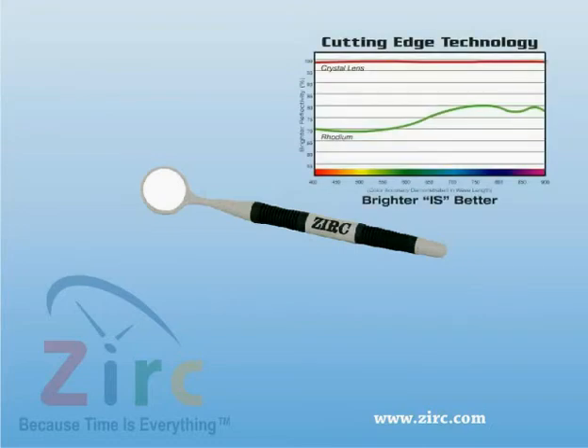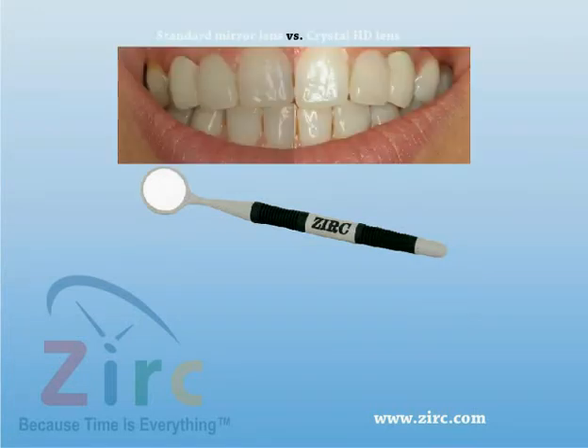The Crystal HD mirror is 40% brighter than rhodium mirrors and has an almost 100% reflectivity. This gives the user a brighter and clearer image, which in turn produces more accurate results.